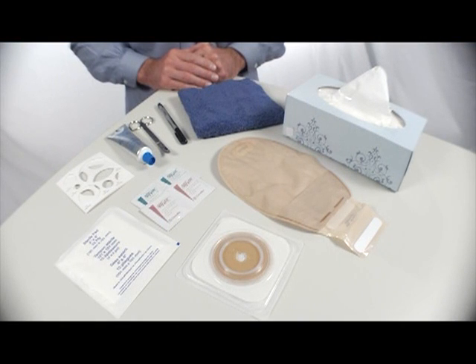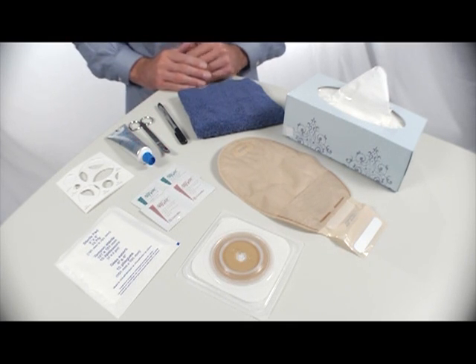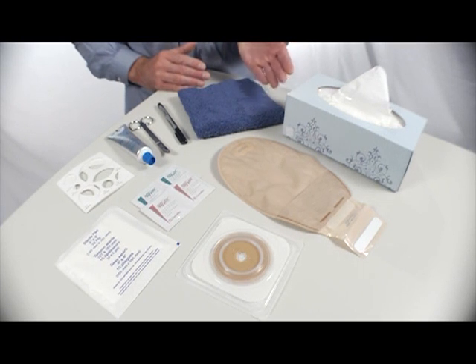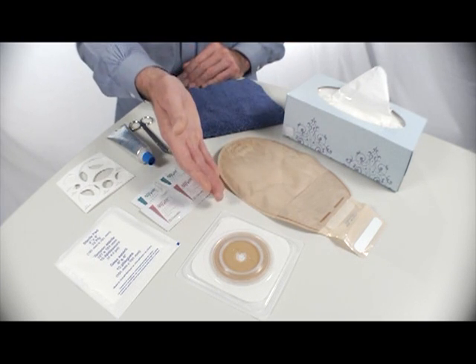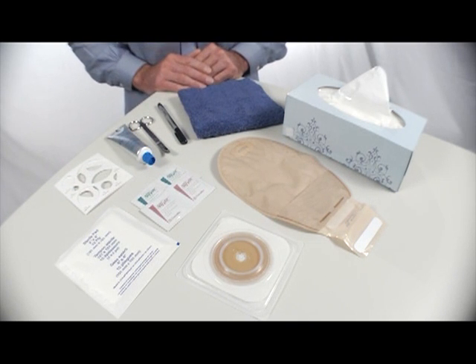Before we begin, make sure to have all of your ostomy supplies at hand, including scissors, if not using a moldable wafer, a felt marker, washcloth or towel, tissues, a wafer or skin barrier, and pouch, and any accessories recommended by your healthcare professional.